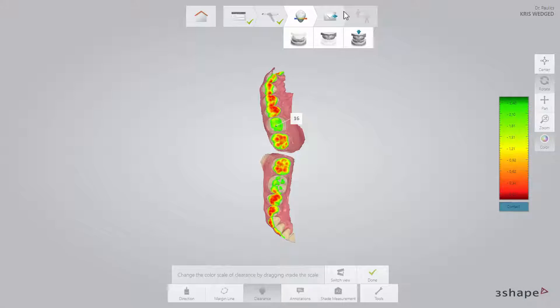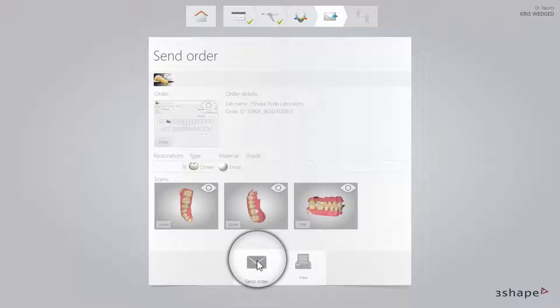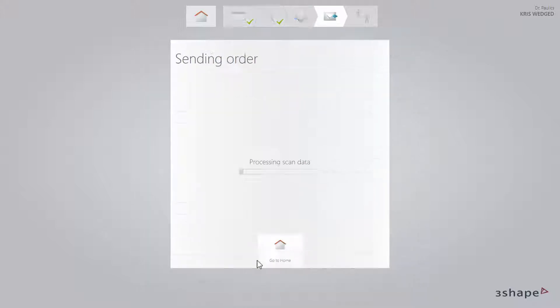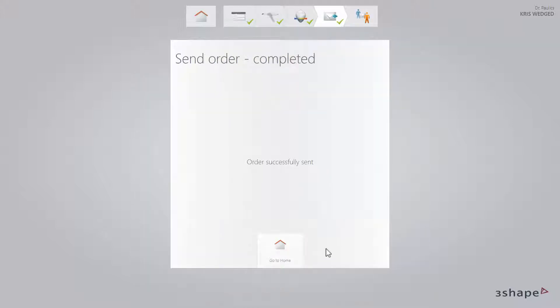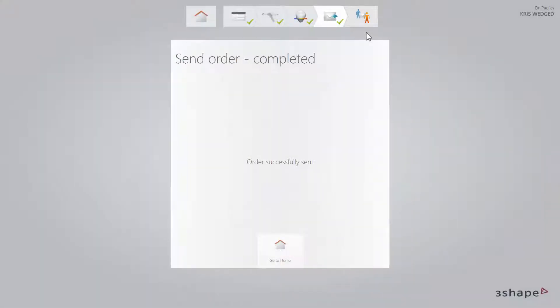Finally, switch to the Send page. Verify the order and press Send Order. When the order has been sent, the 3Shape Communicate window becomes active. You can use it for communication with the lab by writing comments and sending screenshots.